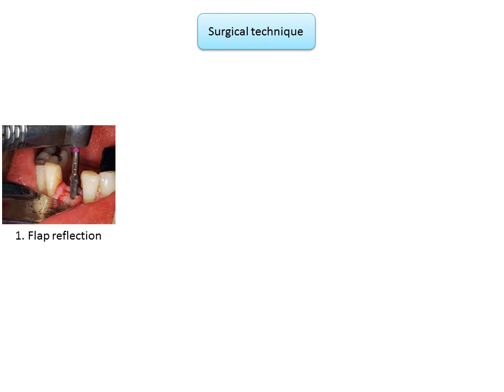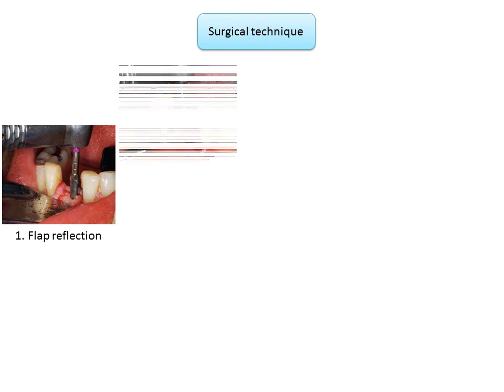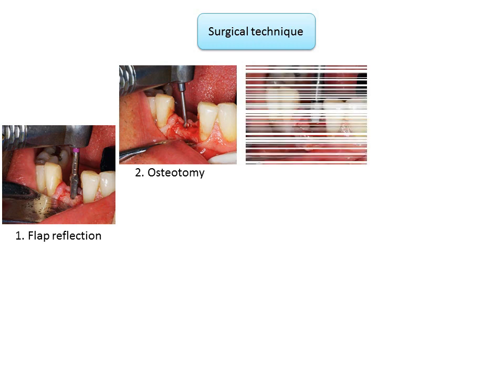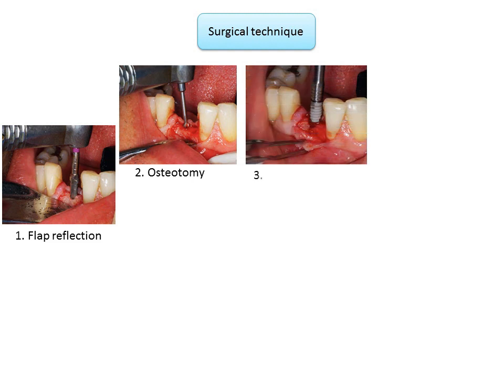In the image you can see that using a retractor, the flap has been pulled down to expose the implant site. Following this, the next step is osteotomy, wherein the bone is prepared to receive the implant. The area is copiously irrigated. The next step is inserting the dental implant. The implant is opened and placed on the appropriate driver, which has been inserted into the handpiece. And if entirely manual implant insertion is planned, the implant is mounted on the hand torque wrench.